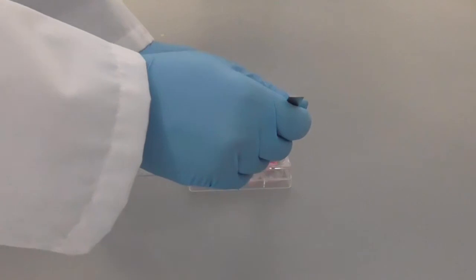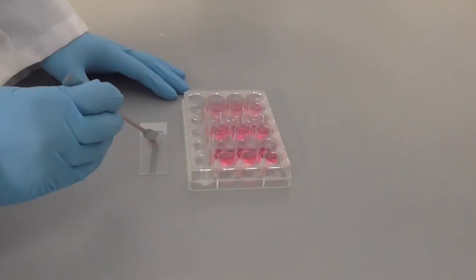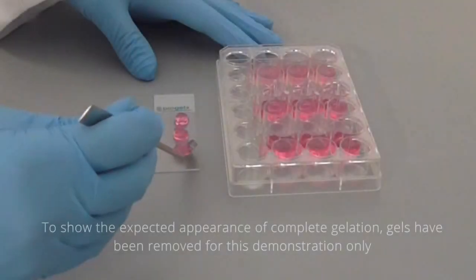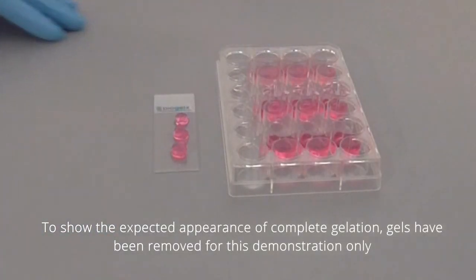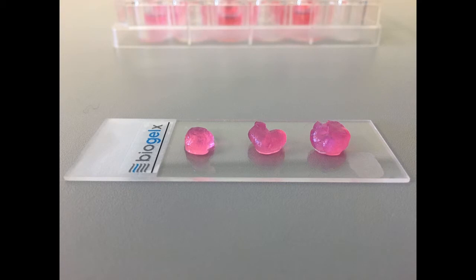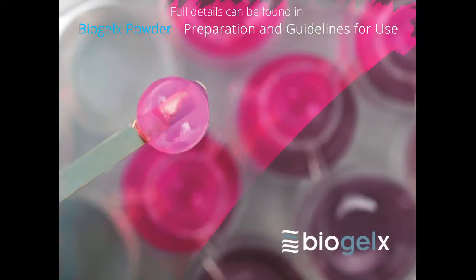After the incubation period, gently remove the surrounding media and replace with fresh cell media for 3D culture. To show the expected appearance of complete gelation, gels have been removed for this demonstration only. Full details can be found in preparation and guidelines for use for Biogelx powder.